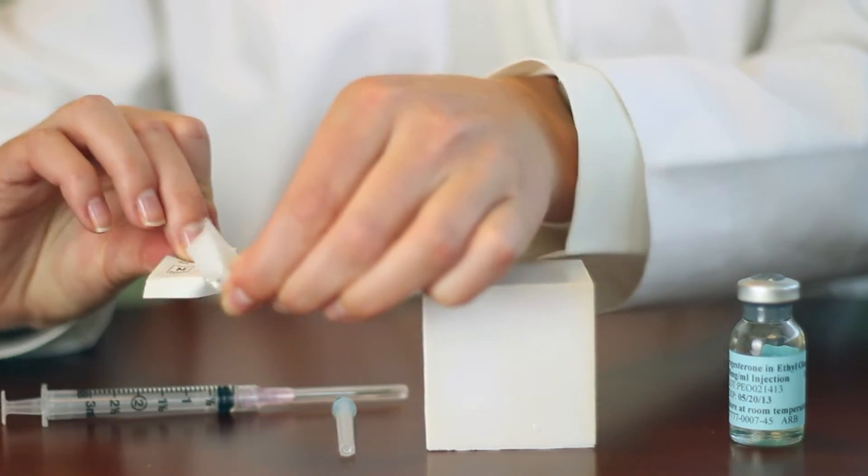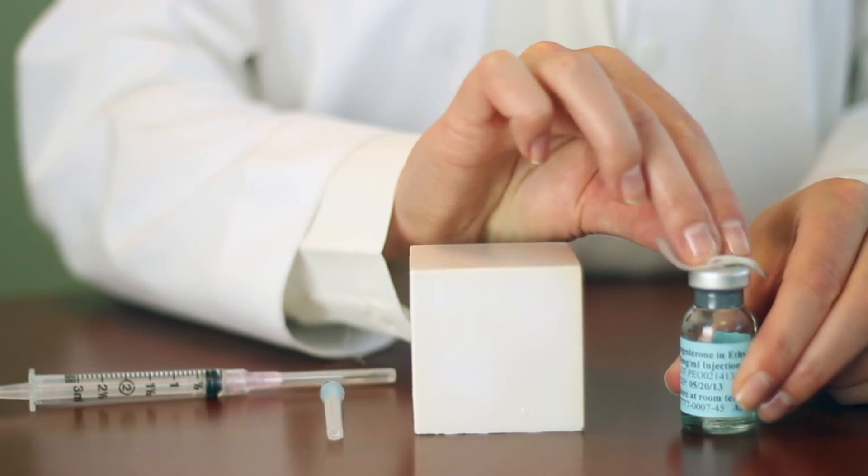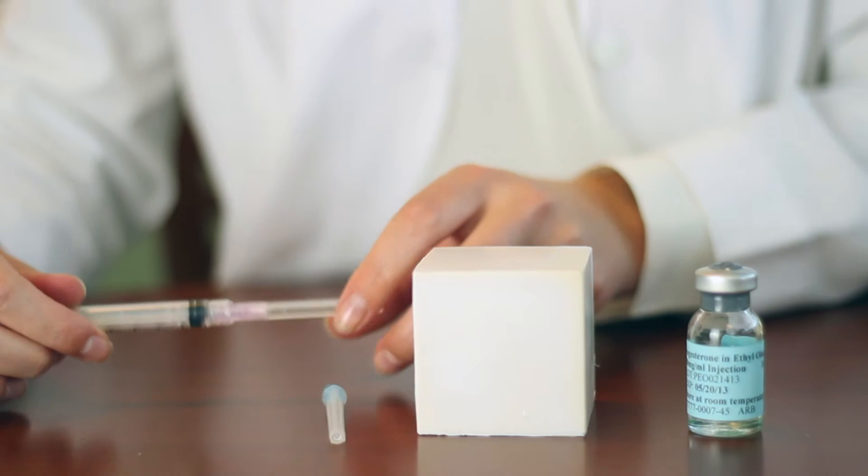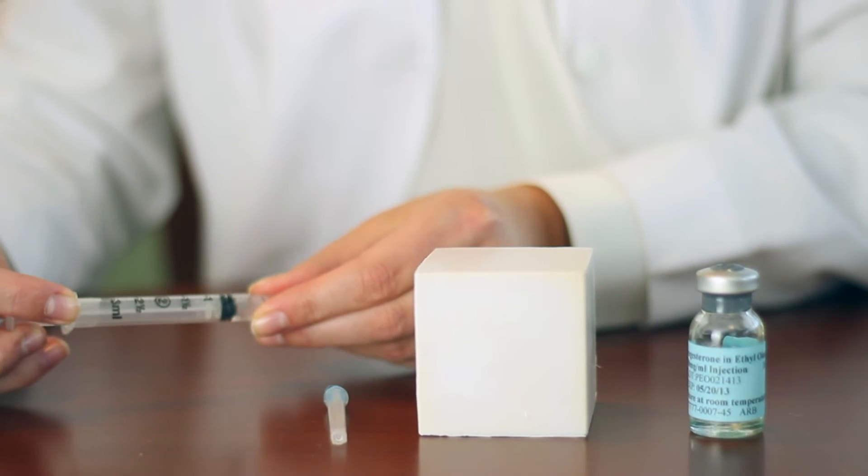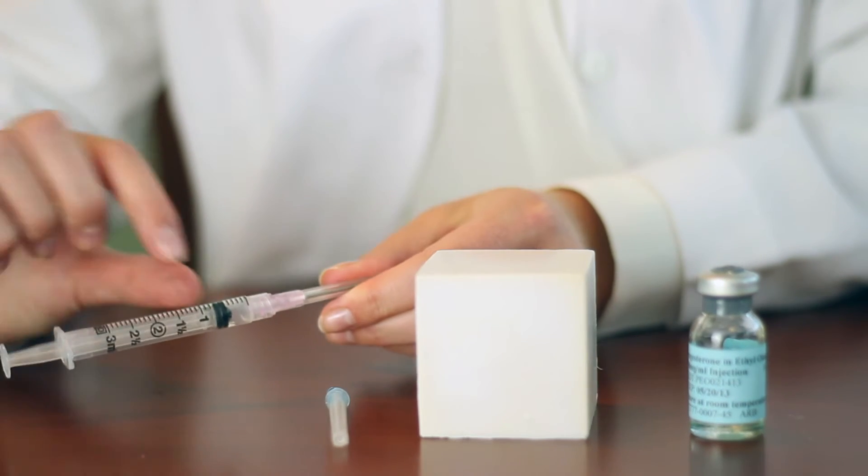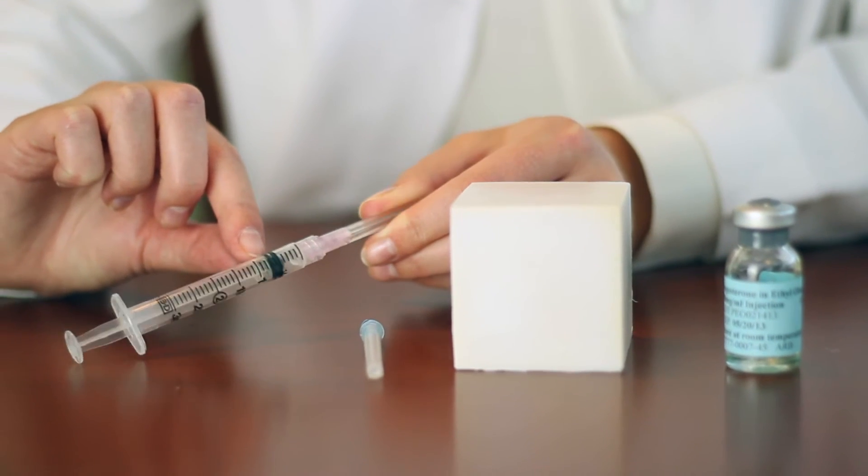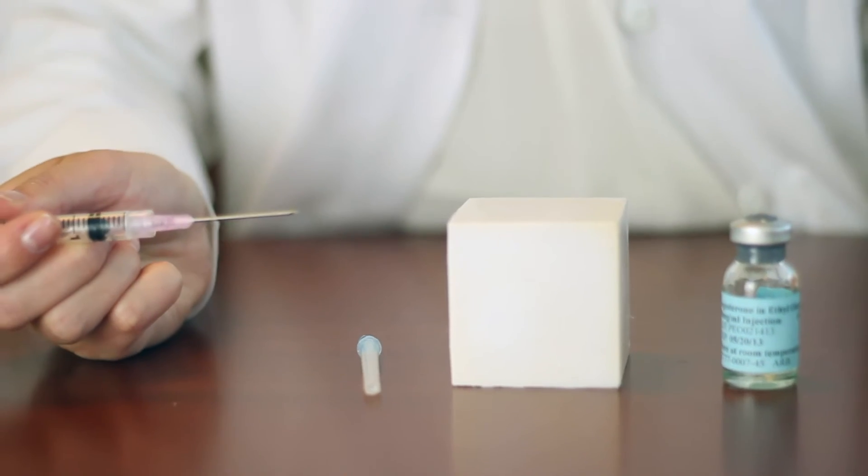Clean the top of the progesterone vial with an alcohol swab. Draw down to your dose in air. The top of the black plunger will represent your dose. Pull the top straight off.